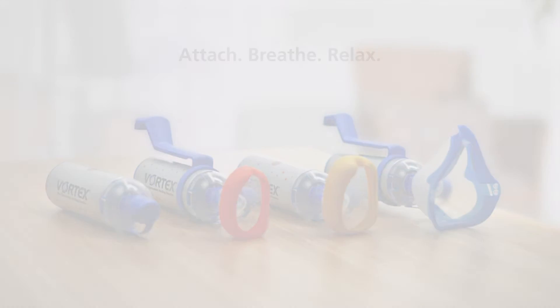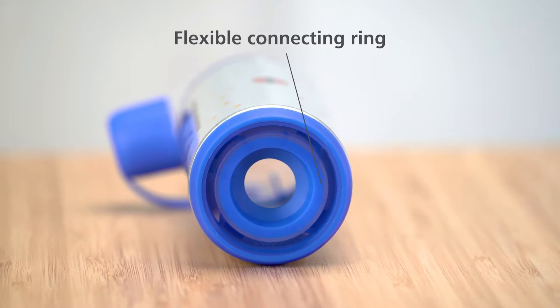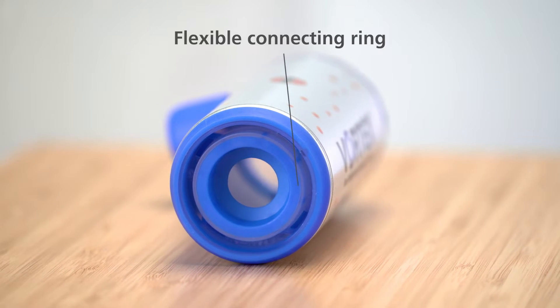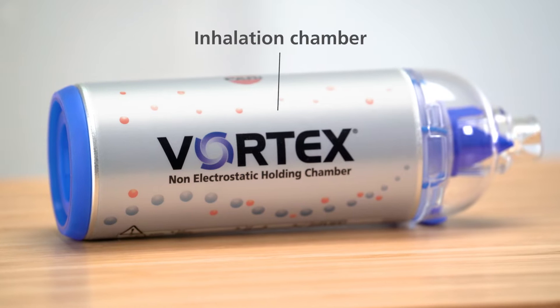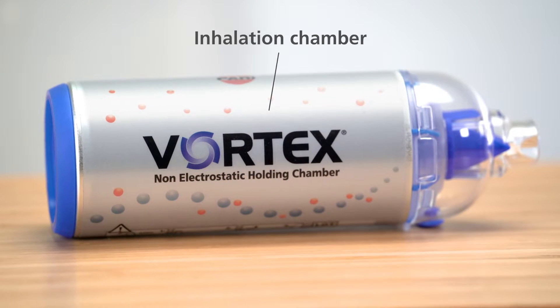All Vortex devices have a flexible connecting ring that's suitable for use with most standard metered dose inhalers. The inhalation chamber is made of aluminium and is anti-static.